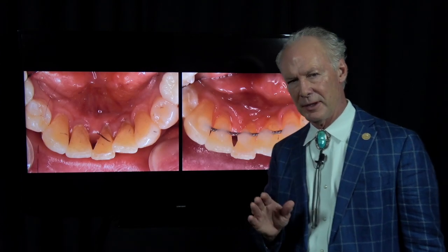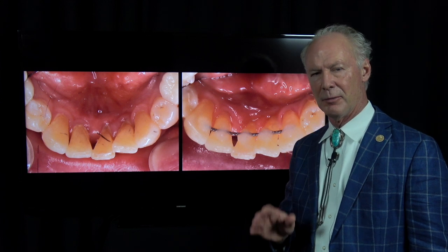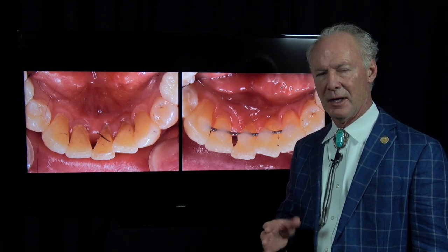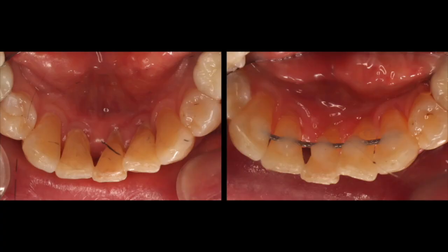Let me be clear: I normally do not like lower anterior lingual bar fixed retainers, but every now and then they come in handy and are needed. This is one of those cases.